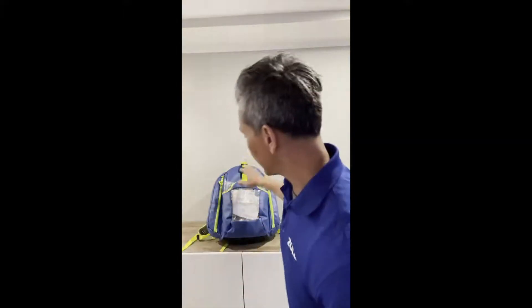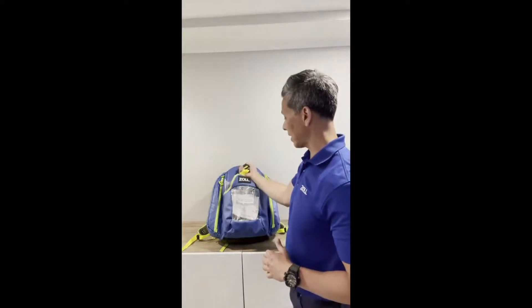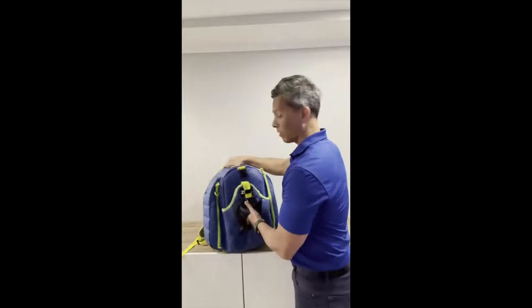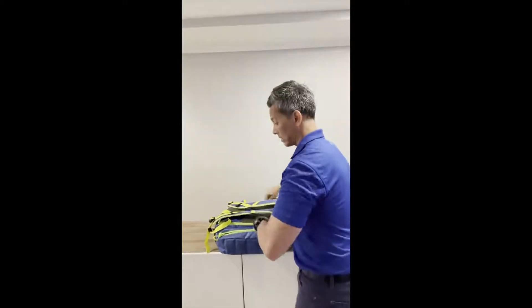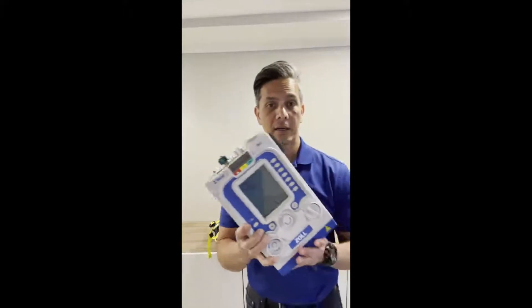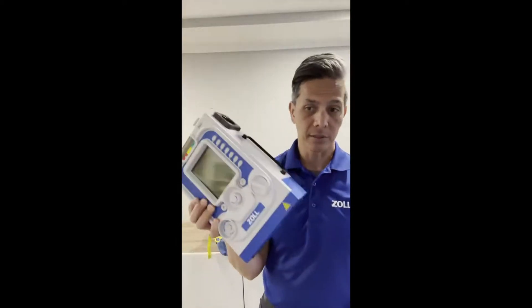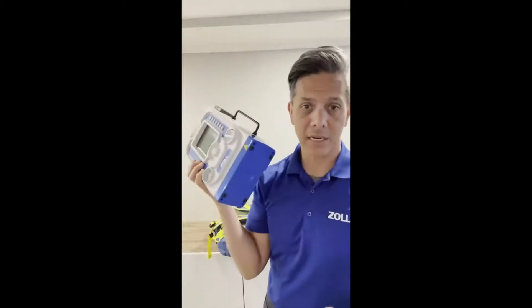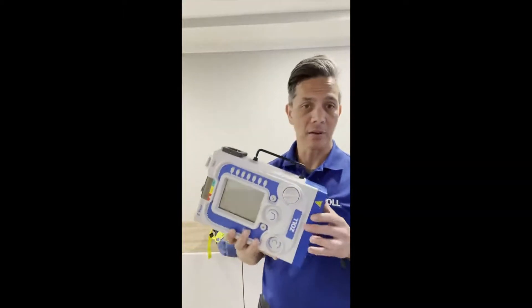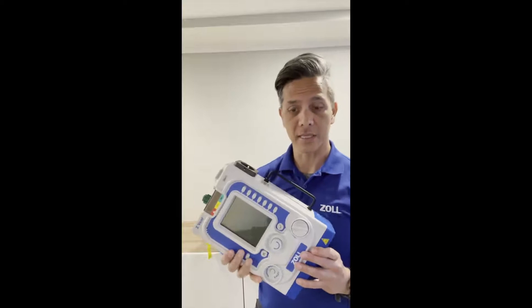The Z Vent comes in this stat bag, and basically everything you need is right here. In the very front I carry circuits — I normally carry two. On the side I can carry accessories like masks and test lungs. Out of the bag, it looks much different from that EMV+. One thing you'll notice right away is that it's just 10 pounds, which is a military spec that works really well for EMS and transport.